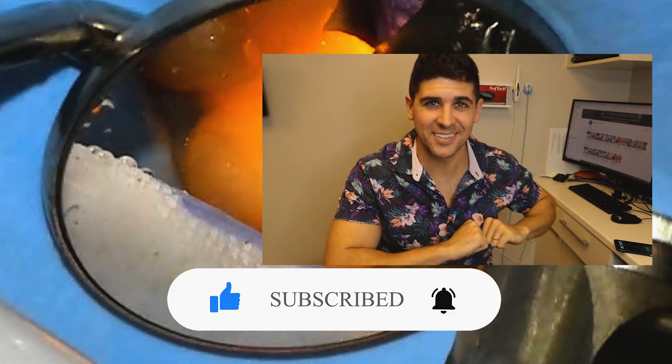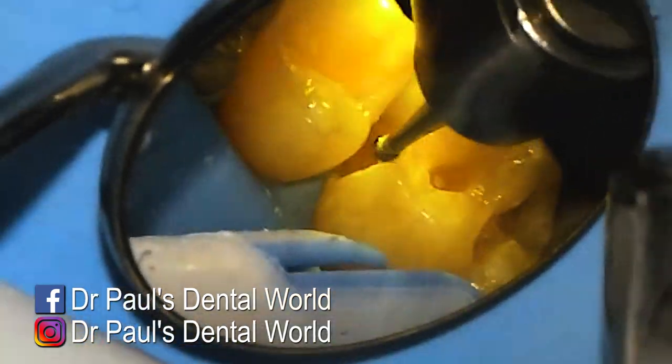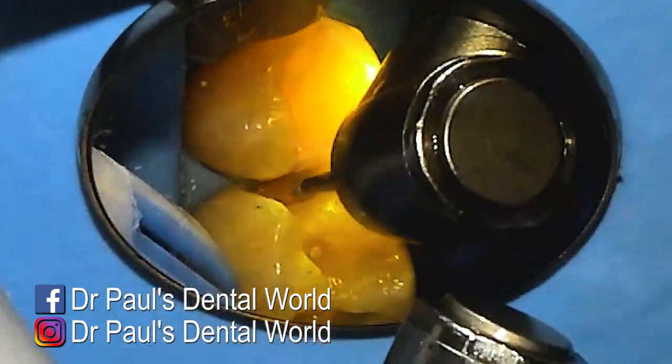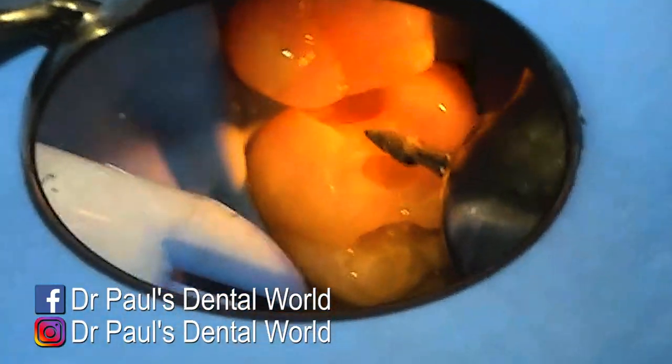That'll be basically the decay removed off of that top part of the tooth. Now we're working on the front half — same sort of process — we're using that slow speed burr just to remove any of that soft decayed tooth structure.